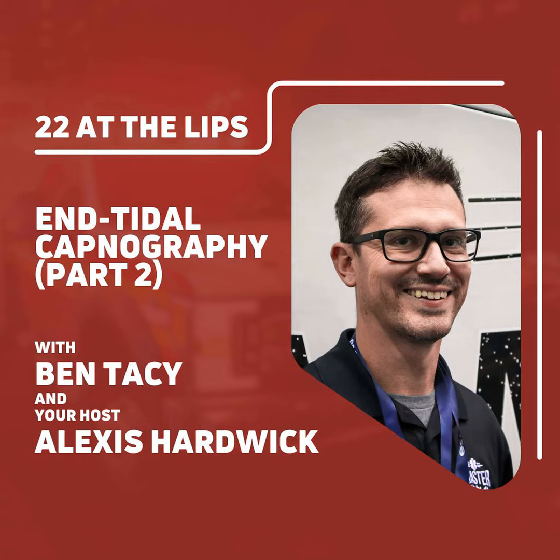So you can listen to the lung sounds, they sound like garbage, and you put them on the pulse ox and it reads 98%, like, oh, they're breathing fine. And they're tripoding, they've got the duck face, they're not making a selfie, but like, oh, they're fine, it's 98%, they don't need any oxygen. But then you could put them on capnography and their end-tidal might be 80, 90, 100.